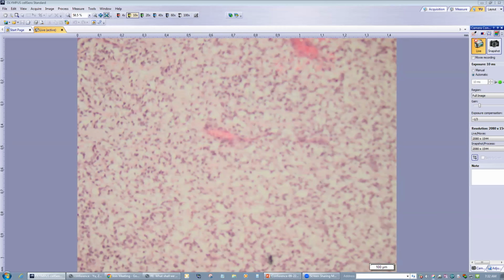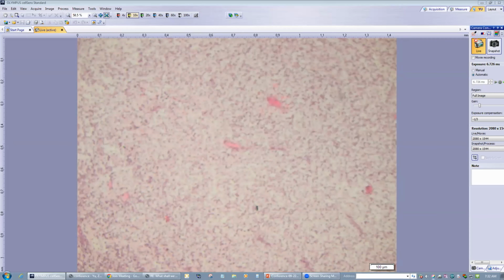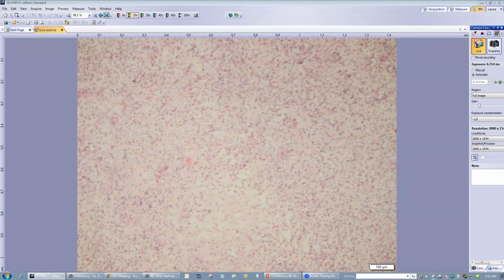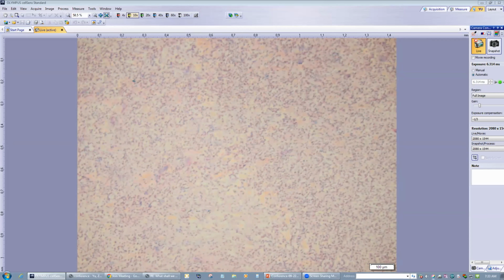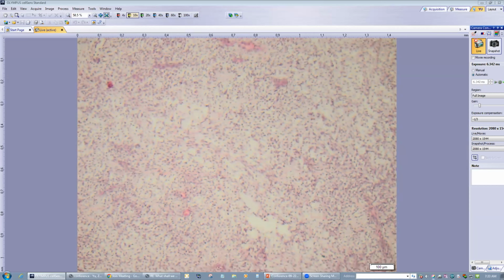So it's unique to the pediatric population. But you can see the cells are clearing, and the vessel is another feature. There are some other morphology variants, but at least you should focally have this clear cell area.